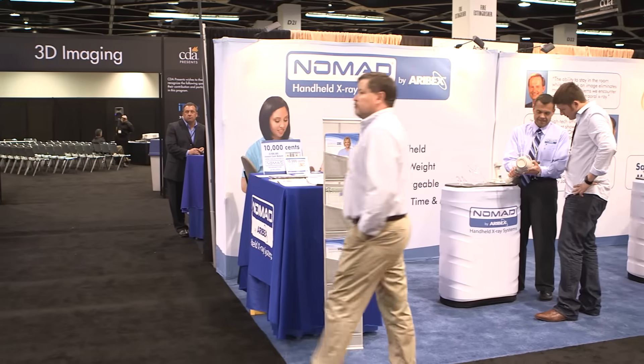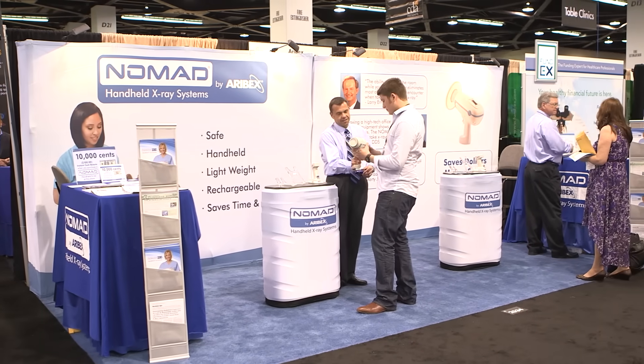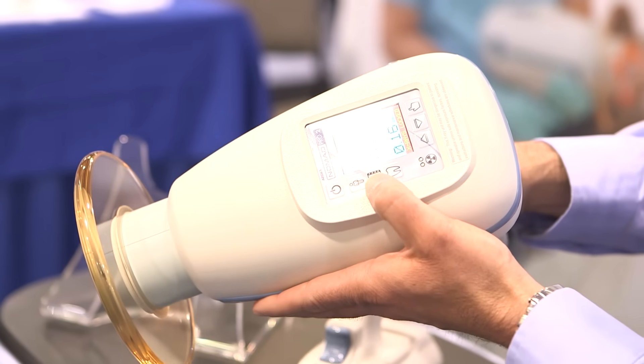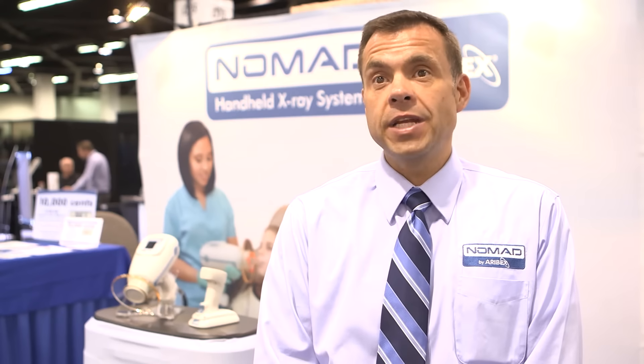Being able to stay right by them is critical. Three key benefits to this product. Number one, not leaving the chair side. Great for children. If you've got a child in the chair, with a traditional wall mount x-ray, you put the x-ray right next to their head, then you leave the room and they want to turn to see where you've gone. You've missed the shot. You're eliminating a lot of those retakes on children.